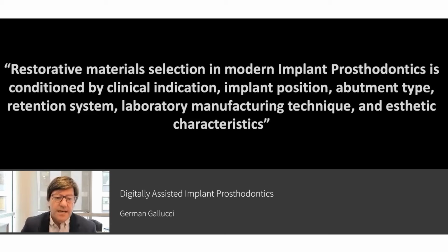So when it comes to the selection of the restorative materials in modern implant prosthodontics, it's not a matter of choice. The restorative material nowadays is going to be conditioned by the clinical indication, by the implant position, by the type of abutment or connection that you will use with the implant, and the retention system, the laboratory manufacturing technique, and the aesthetic characteristics.